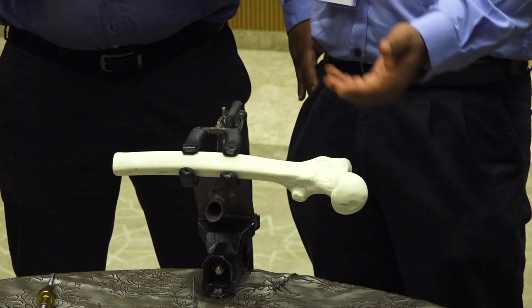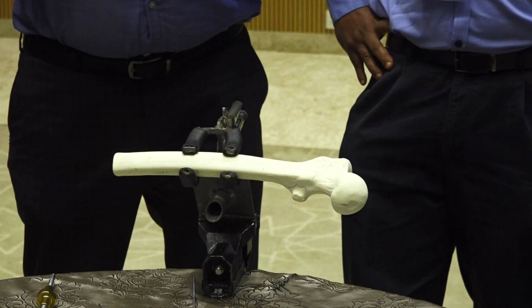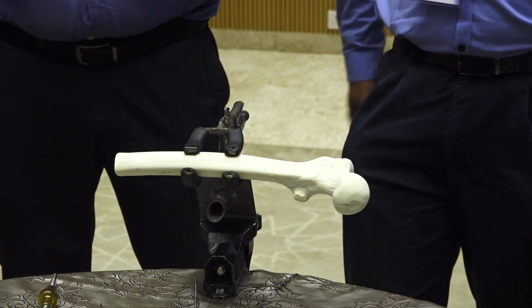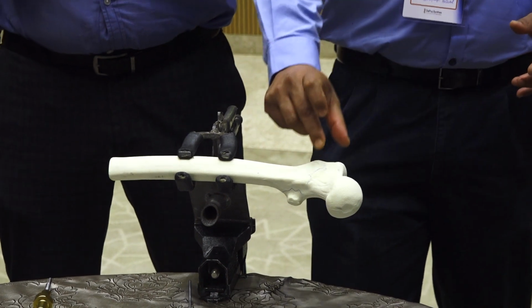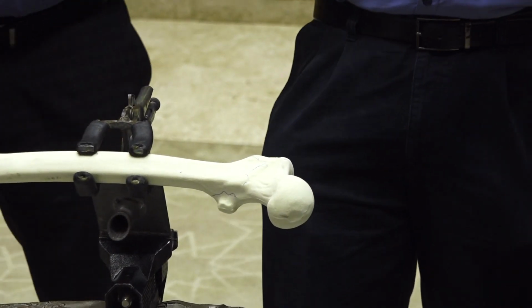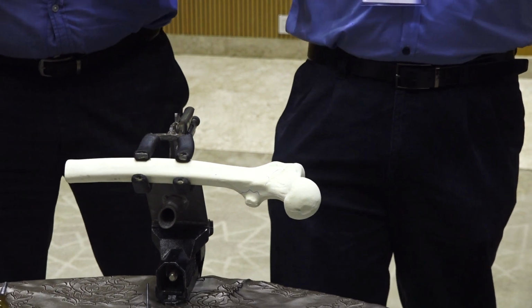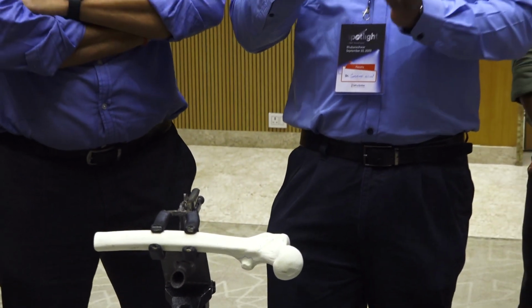But many times, even if we try to do a proper entry point, we usually land up in the fracture. So better to have a good provisional reduction of the GT and try to hold the GT with some form of K-wires or pointed reduction clamps. If you can't see it properly, open it and try to have a good provisional reduction so that you have a good entry point.